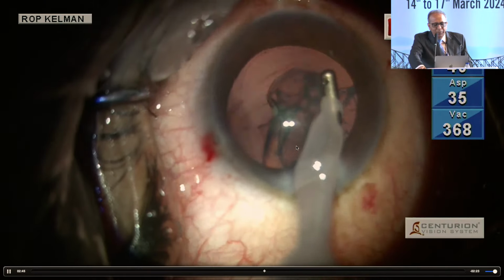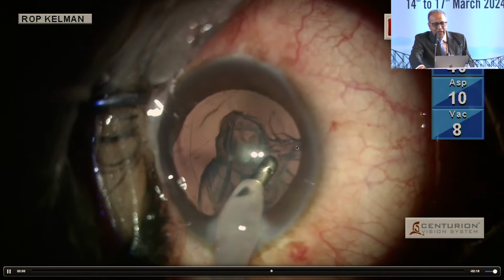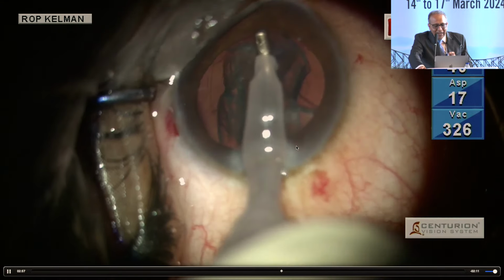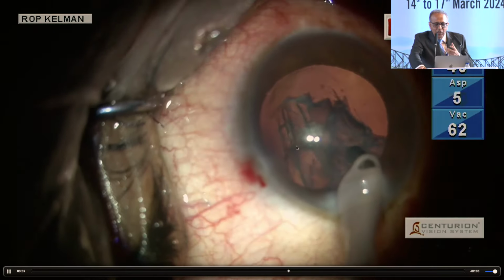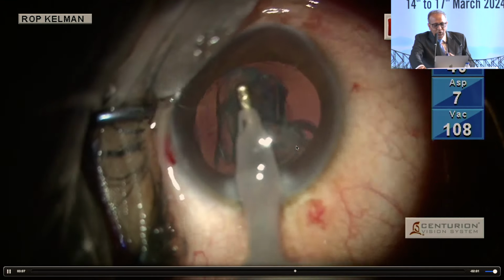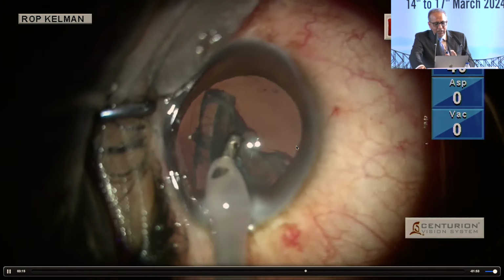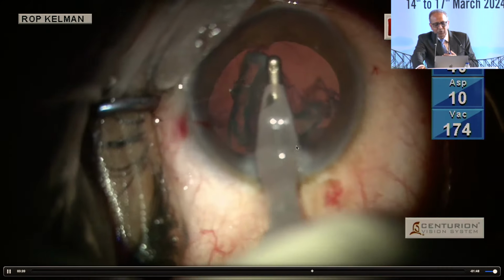Now, how do we use epinucleus as a shield? I dislodge it from all the sides and do not aspirate it. And when I am not aspirating it, I am not exposing the fluidics to that extent, so that the vitreous doesn't hydrate and doesn't come out. So the IOP is okay, it's not that low. Ideally, it should have been much lower. I'm trying to dislodge, but till the time I totally dislodge, I am not going to aspirate it. The epinucleus shield is still protecting the posterior capsule.